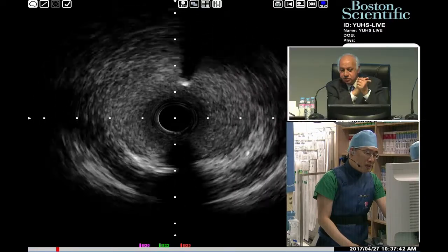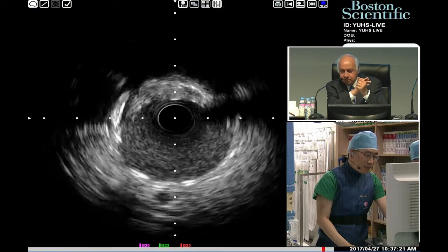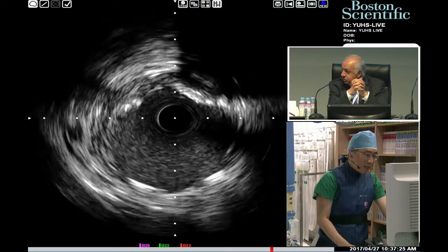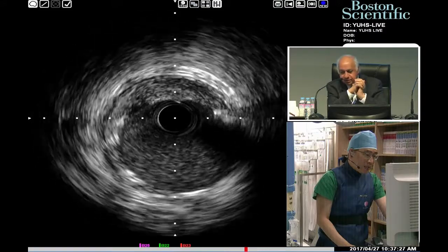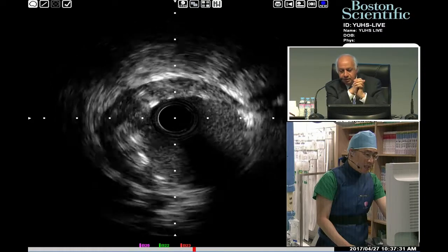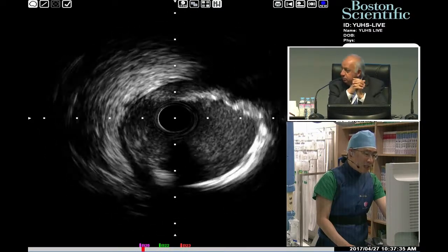I have a question to you. How can the patient tolerate the procedure with a spinal disease for a longer time? So it should be as rapid as possible for the left main LAD, with no need for optimization for a longer time, because this patient cannot lie flat, or what do you think?